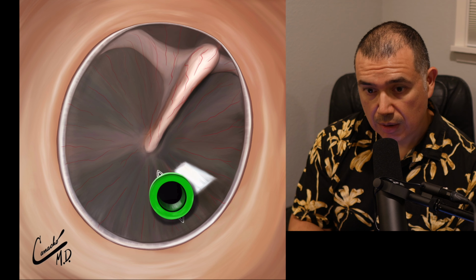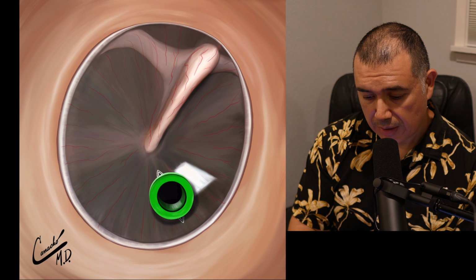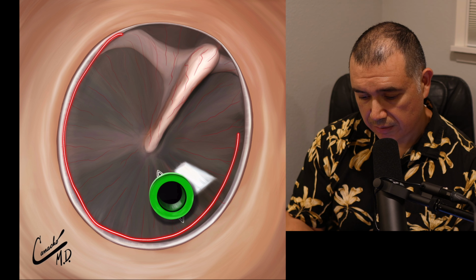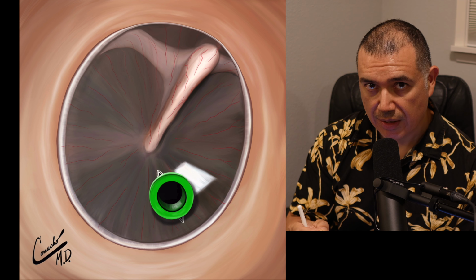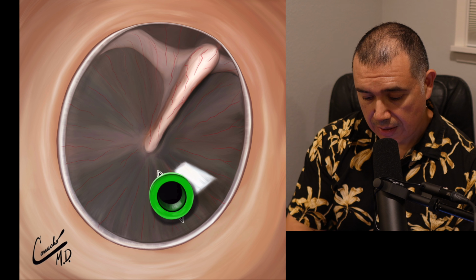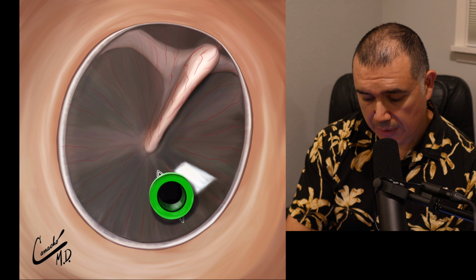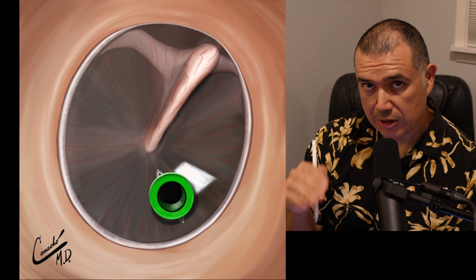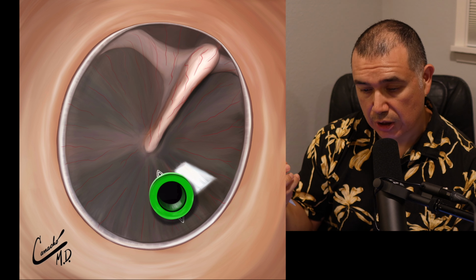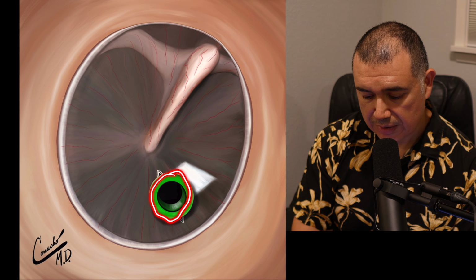Here is the eardrum, and you can see the anatomy. There's a bone here. There's the eardrum itself. The eardrum is very thin. There are 3 layers, but we can really see through it. It's so thin. And what we do is we go to the operating room, we use a microscope, make an incision. Once we make the incision, if there's any pus or fluid in there, we suction it out, and then we place the ear tube.